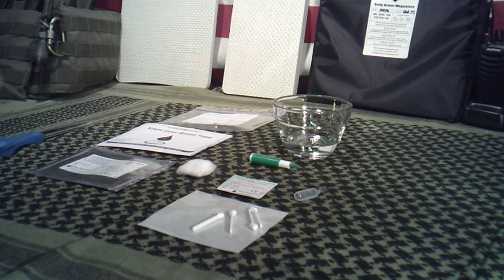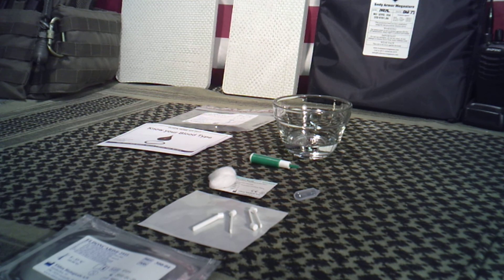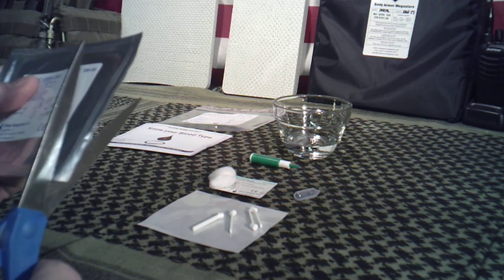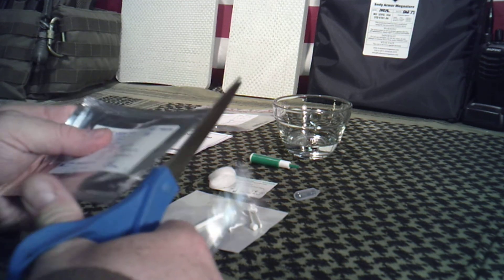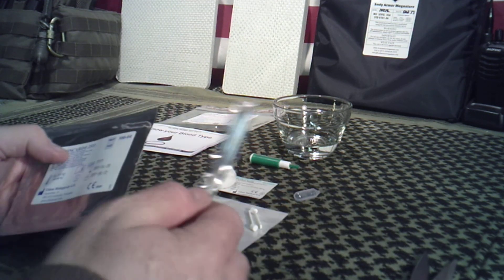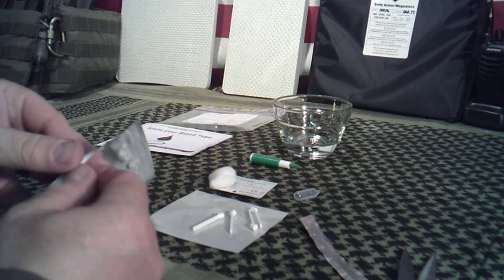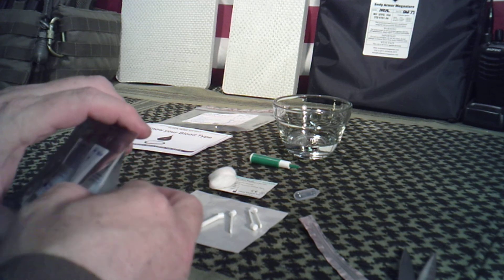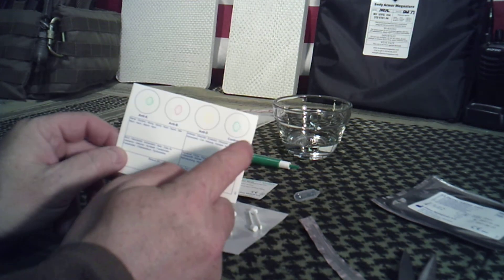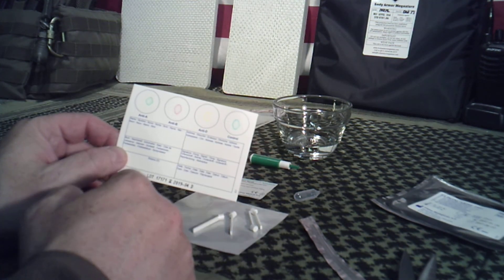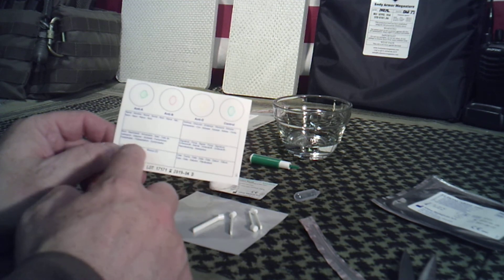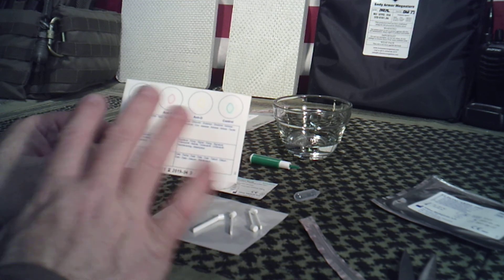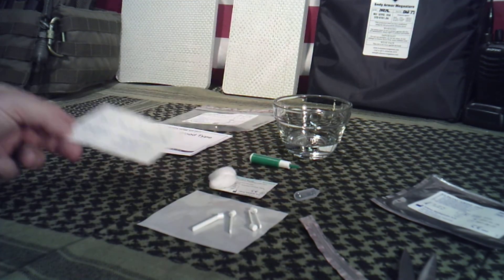What you're going to do is you're going to open this first. If it's a weird camera angle, the reason is because I have my son that I need to be able to access him. Just take and cut along the edge, make sure you don't cut the card, and then pull the card out, being careful not to touch any of these circles. There's a reason, that's where you actually do the blood test. It has a place for your name, address, stuff like that. But if you want to keep this card on file, you actually could.